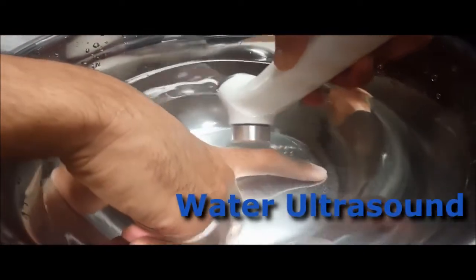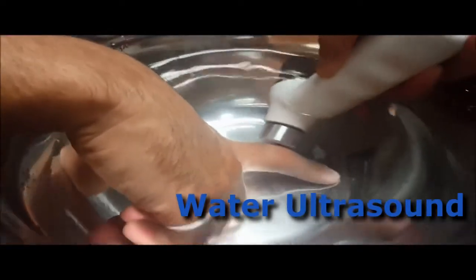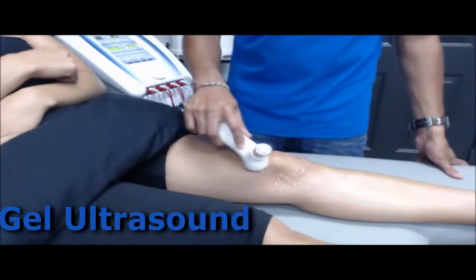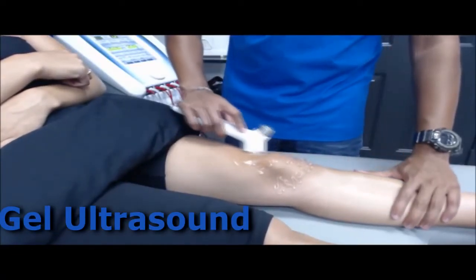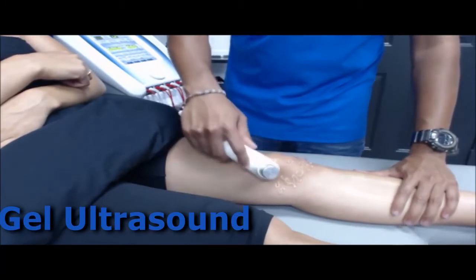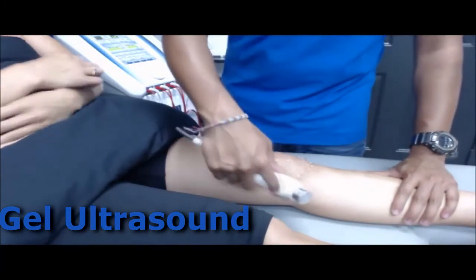These effects work hand in hand to help reduce local swelling, pain, chronic inflammation, and according to some studies, promote bone fracture healing. Some conditions we treat with ultrasound include tendinitis, joint swelling, muscle spasm, and unwanted scar tissue.